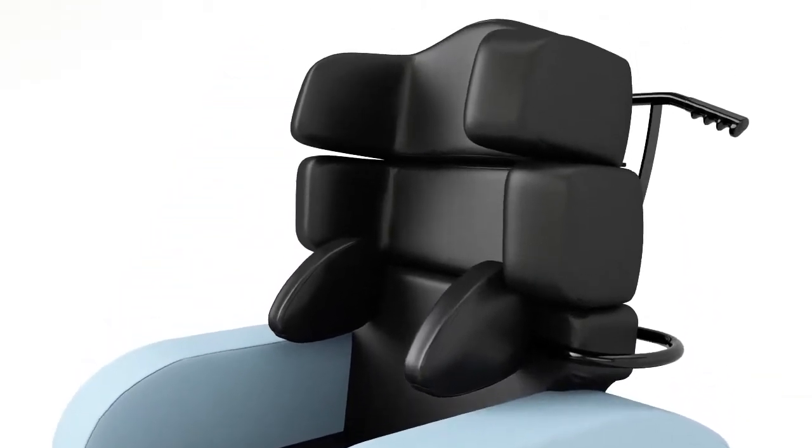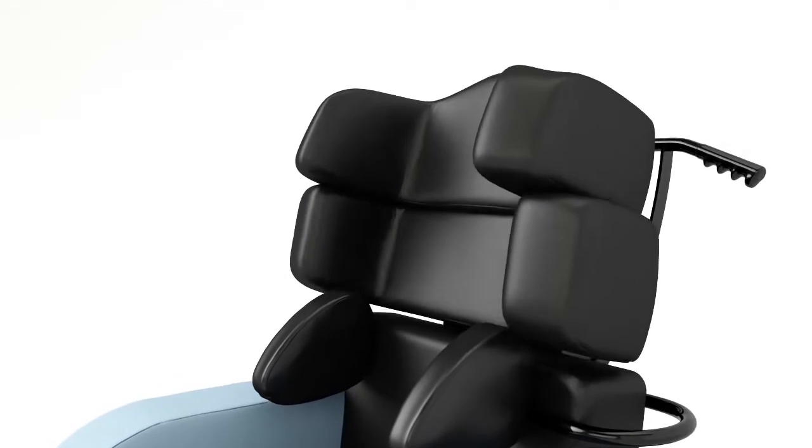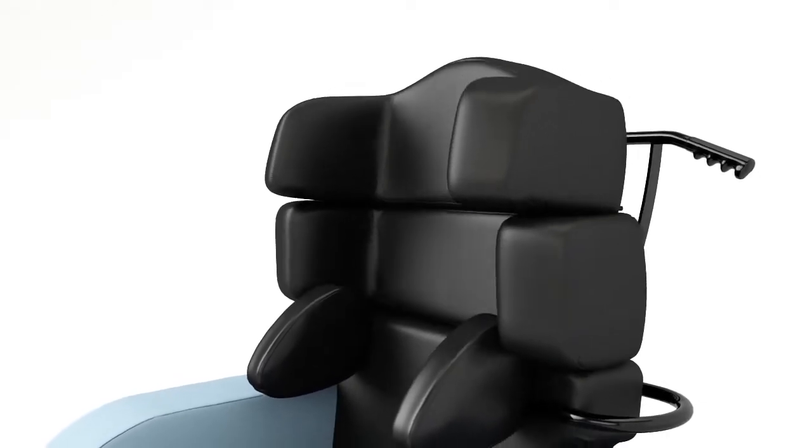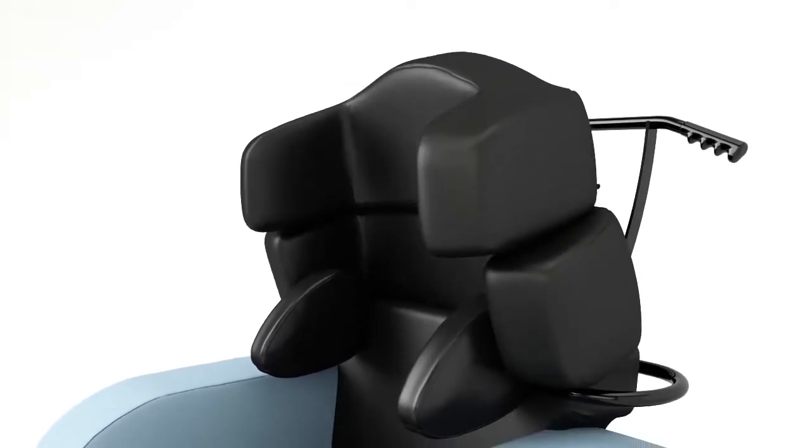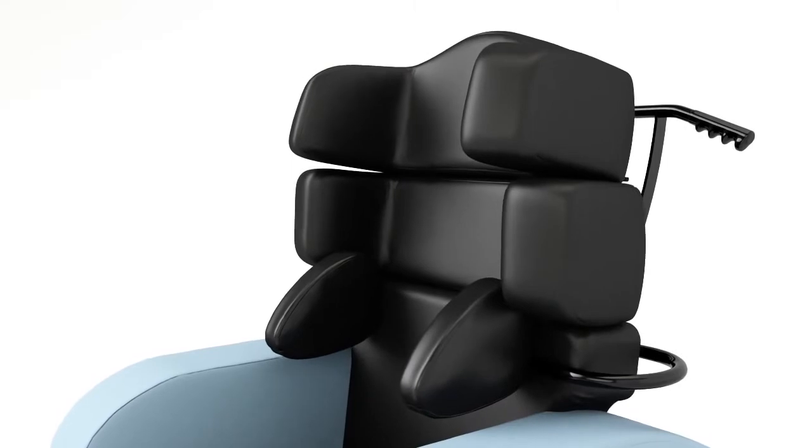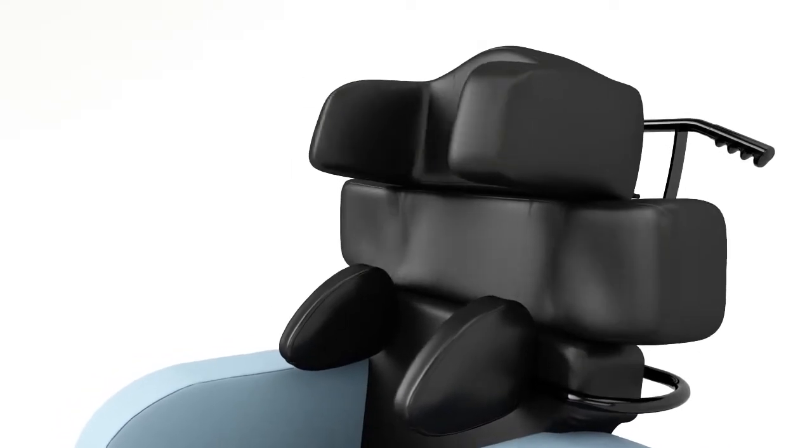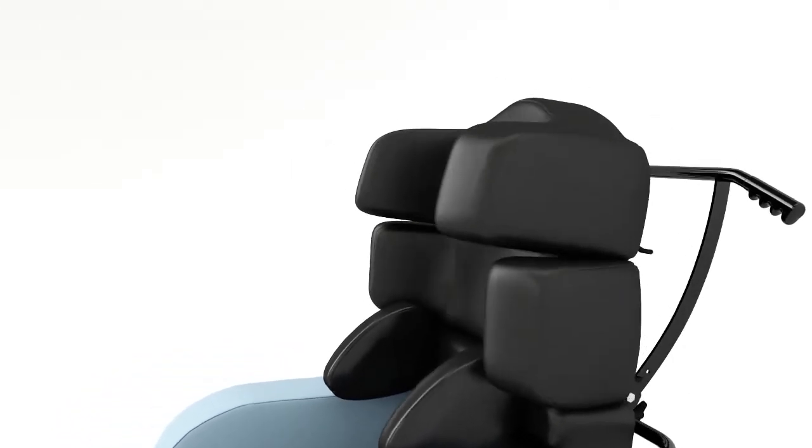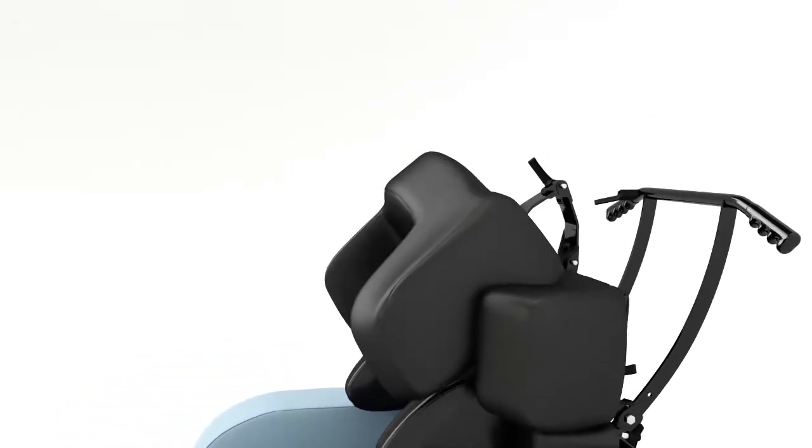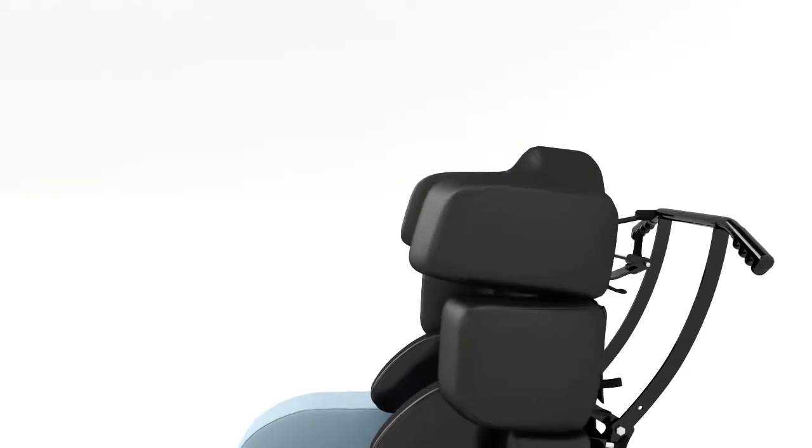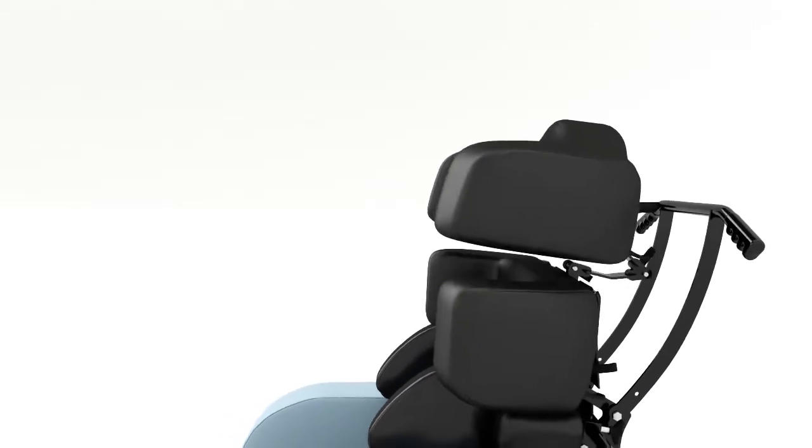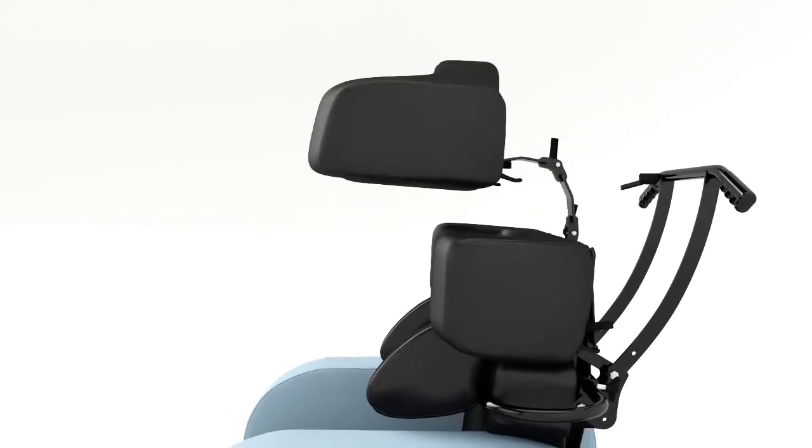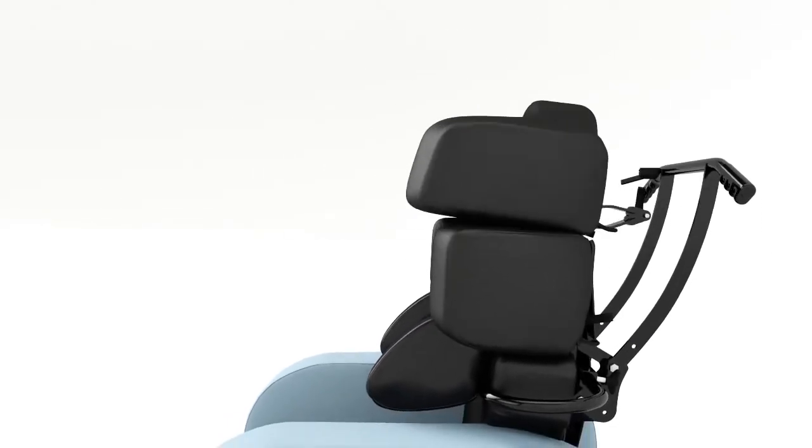The shoulder and head support will adjust to support the user's back, and the wings can be individually set to support the upper body. The headrest will independently adjust to support those with kyphotic curve or those with hyperextension.